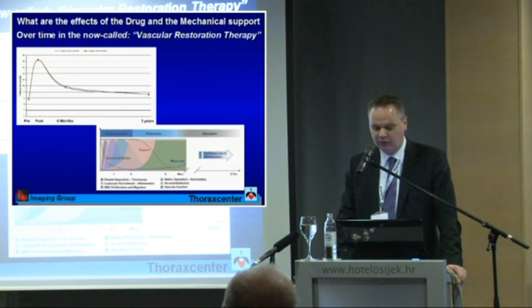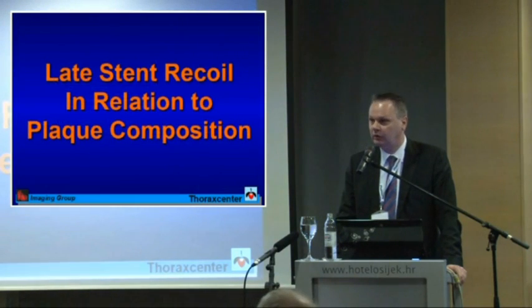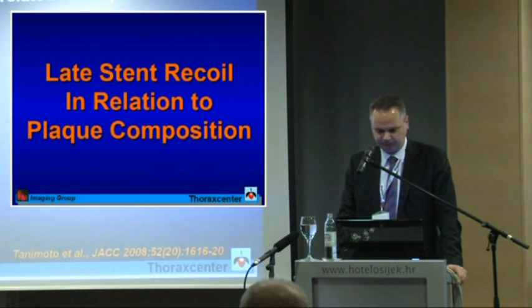So now coming back to the artist impression that we had in the beginning. How long does the support take, and does the support and the degradation of the stent have any relation to the type of patient in which we put the stent, or also with the type of plaque in which we have implanted the stent? So we investigated the late stent recoil in relation to the plaque composition.